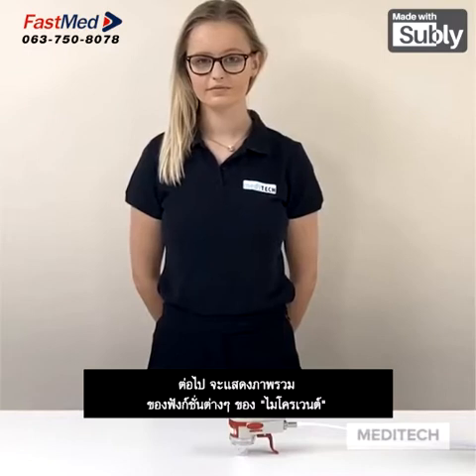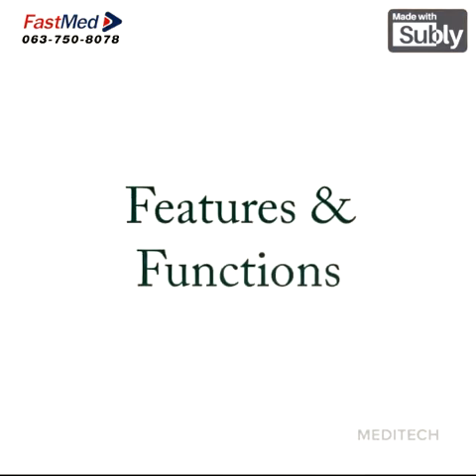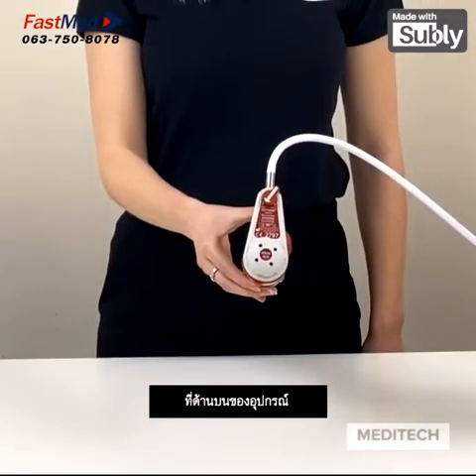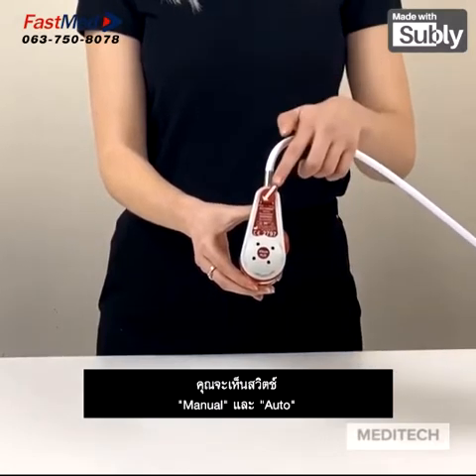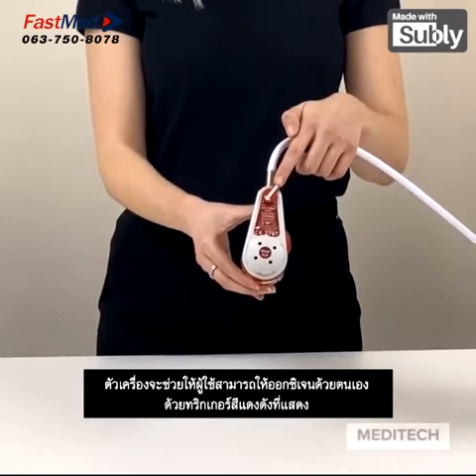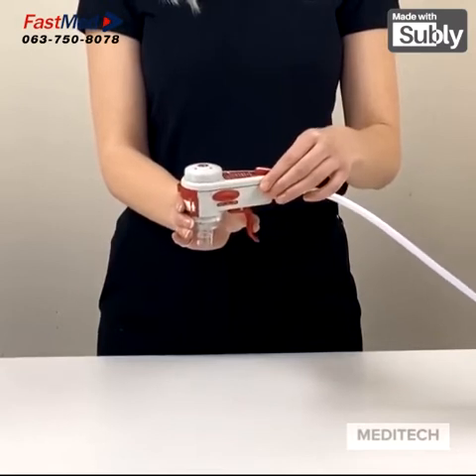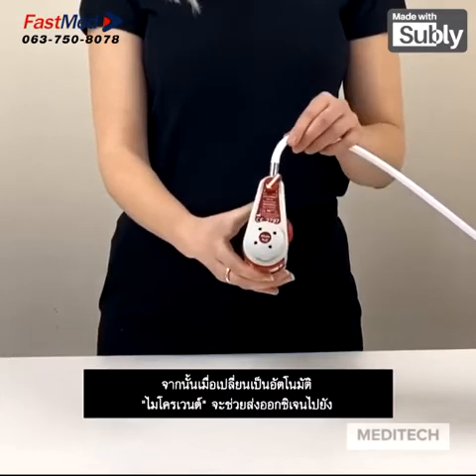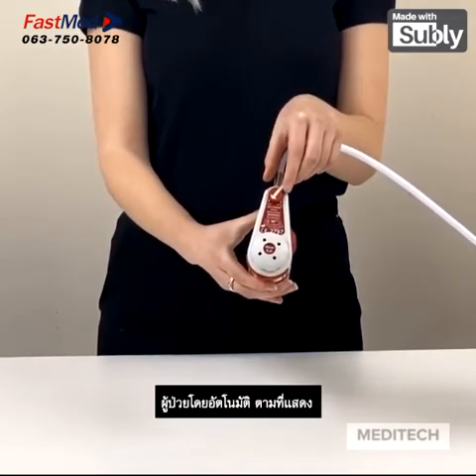We are now going to give an overview of the different functions of the Microvent. On the top of the device you will see a manual and automatic switch. When in manual mode, this allows the user to give a manual breath of oxygen with the red trigger as shown. When switched to auto, the Microvent automatically resuscitates the patient as shown.